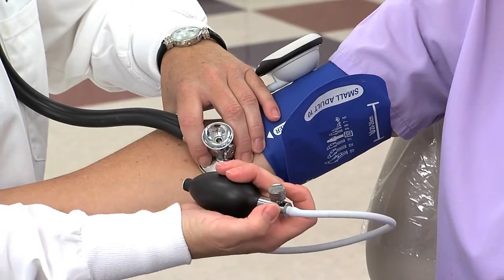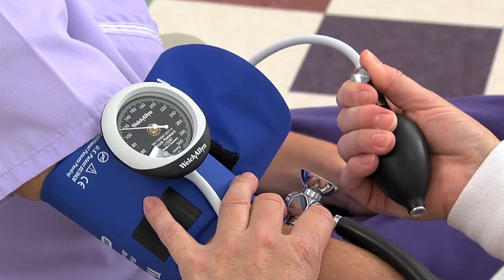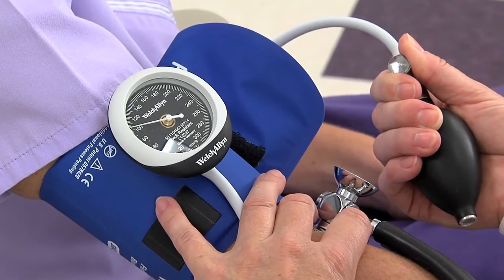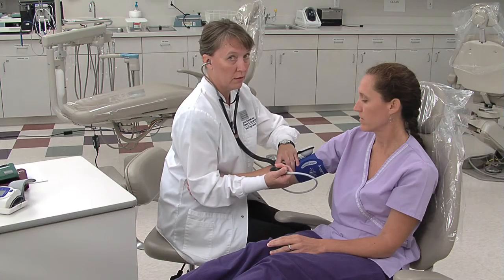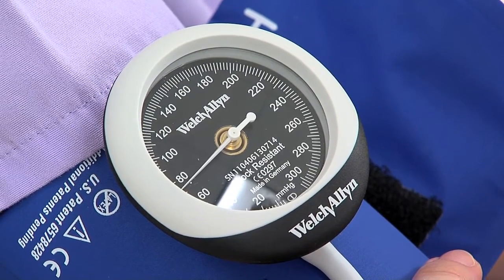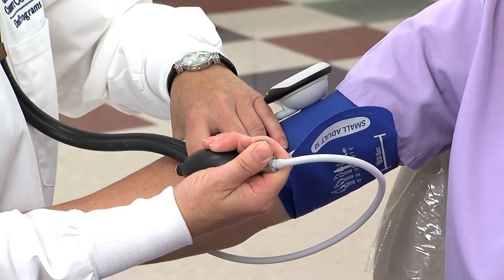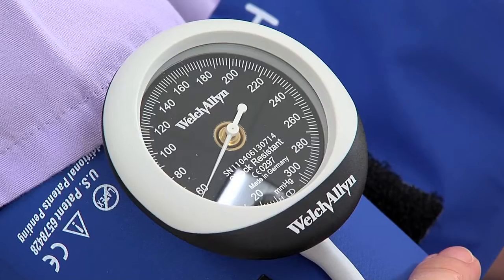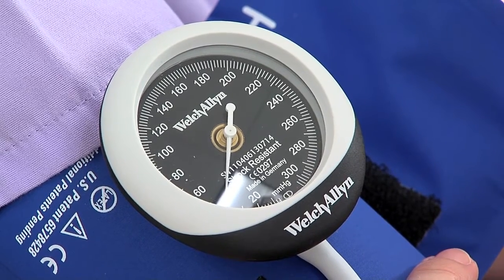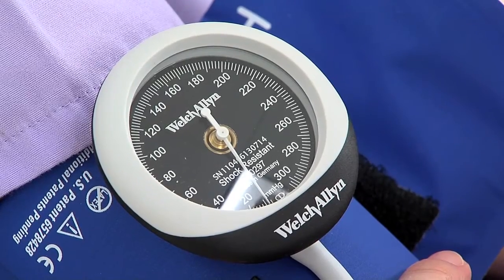Once you have that reading, you want to release the valve slowly, paying attention to the sounds that you hear. The first beat that you get will be your systolic, which is the top number of the blood pressure. You want to continue to release this slowly until you no longer hear any sounds at all. As you hear the last sound, note the number on the gauge, and that will be your diastolic number. You want to slowly release the air until you are completely to zero.